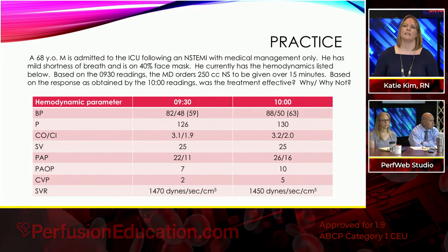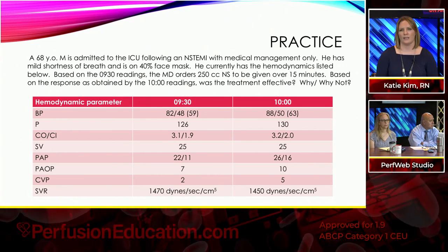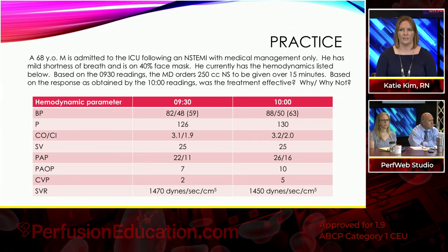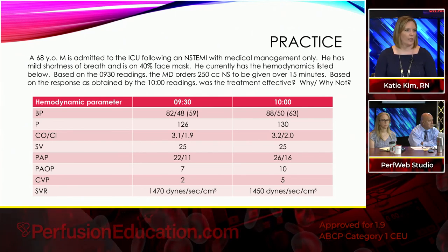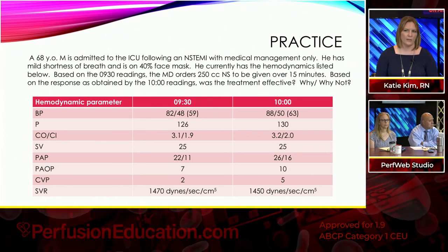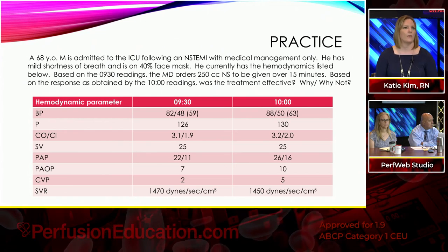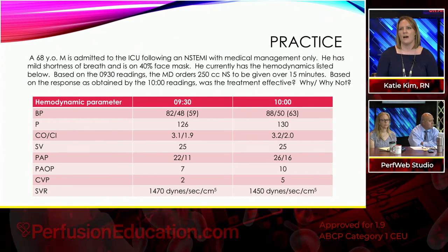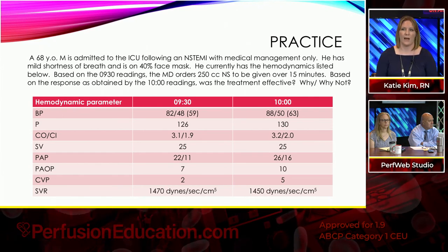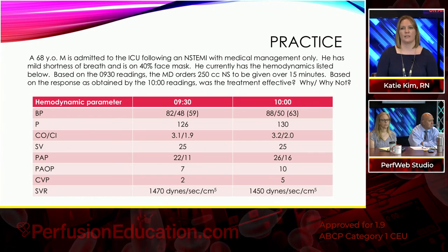So here is just a little practice scenario, very basic. You've got a 68-year-old male who's admitted to the ICU. He had a non-STEMI, medical management only. He had gone to the cath lab and comes back. They can't do anything about it, but he had some hypotension in the cath lab, so they left a PA catheter in. He didn't need to be intubated. He's only on 40% face mask, and he currently has the hemodynamics listed below.